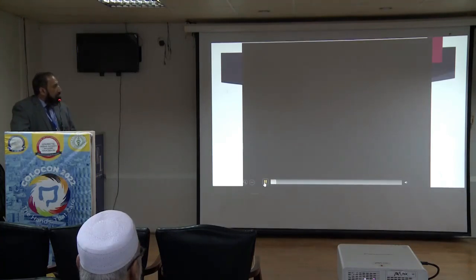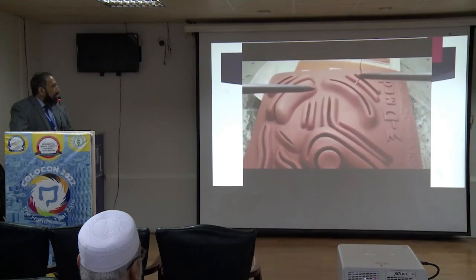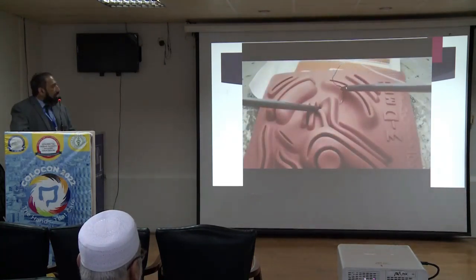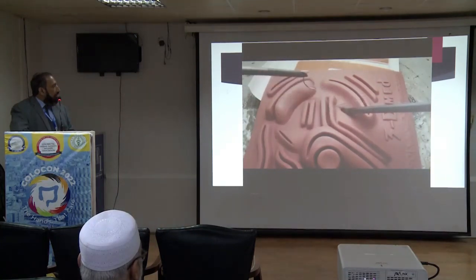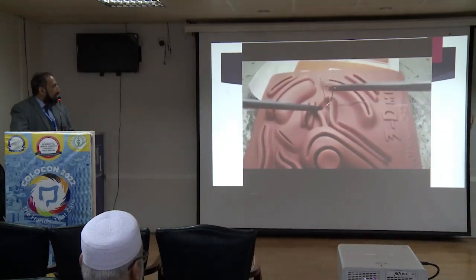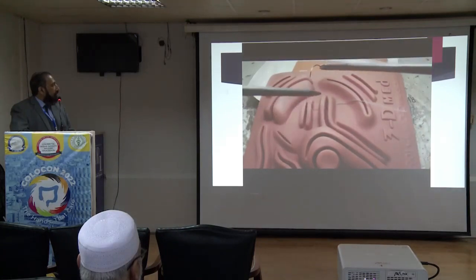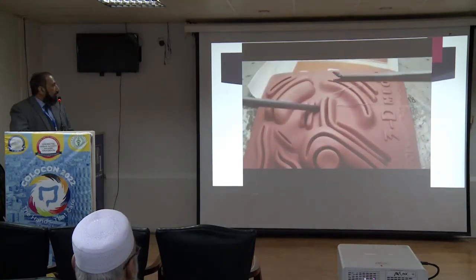This is another video showing the same process. The needle is held at point C. Tissue is displaced with the help of the assisting instrument. An angle of 70 to 90 degrees is made. The needle is entered following axial rotation of the needle holder, and held at point B. Reset it again at tissue level. Again the tissue is displaced and the sequence is repeated on the other side. The other instrument acts as a fulcrum, a pivot, to prevent damage to the tissue and pull the thread from the margins.